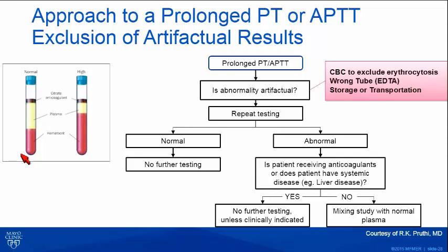Then it's a clinical judgment to decide whether the assay should be performed at this time or not, because if the patient is on an anticoagulant, as Dr. Nichols just mentioned, we do not want those kinds of samples. So if the patient is on a factor Xa inhibitor or direct thrombin inhibitor, maybe you can consider redrawing the sample after 5 half-lives.